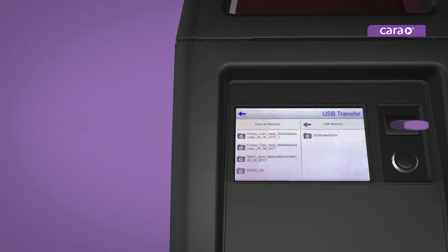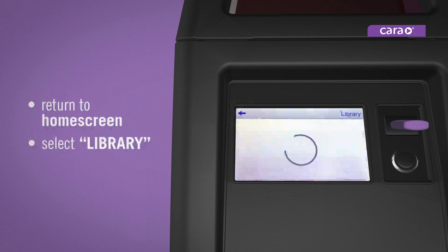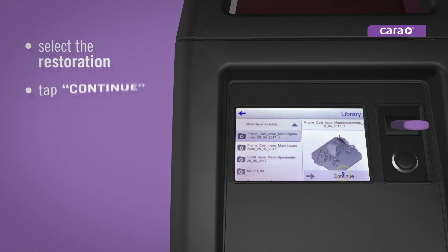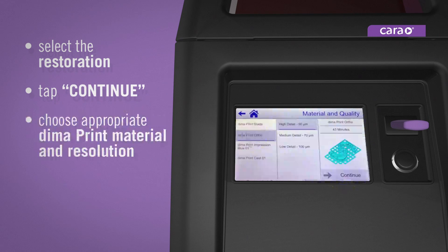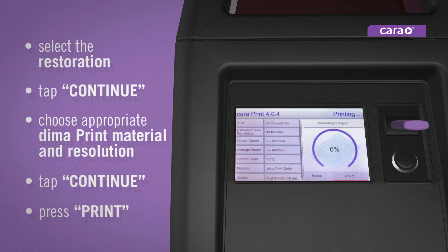Tap the arrow in the top left corner to return to the home screen and select library. The most recently added restoration will appear at the top. Select the restoration you wish to print and tap continue. Choose the appropriate dima Print material and the desired resolution. Tap continue and confirm by pressing print on the next screen. Your restoration will be printed in under an hour.